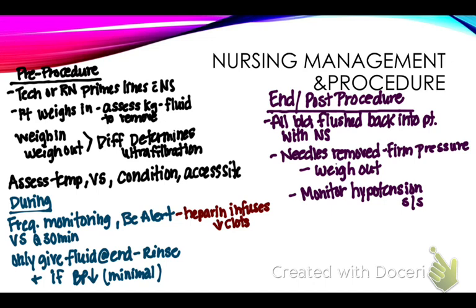Of course, they still lose some blood, hence the reason they're anemic and the fact that their kidneys are not producing or helping with the erythropoietin. So needles are removed. There's firm pressure applied. And remember, it's arterialized, so you're going to hold it for 3 to 5 minutes. Usually the patient will hold it. They know, they do this every week.